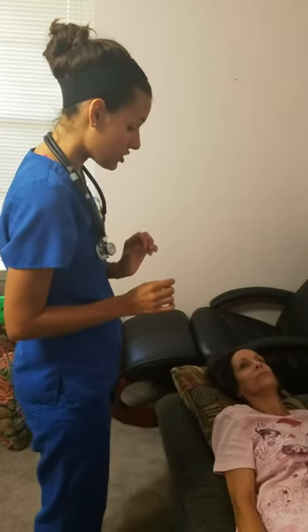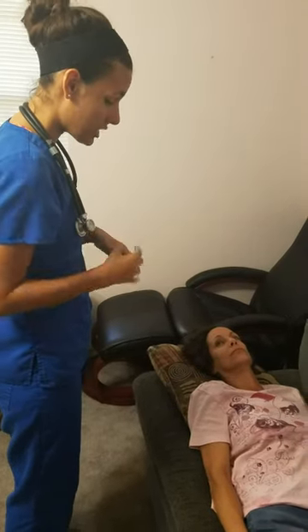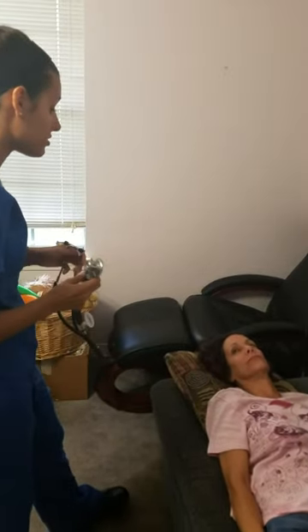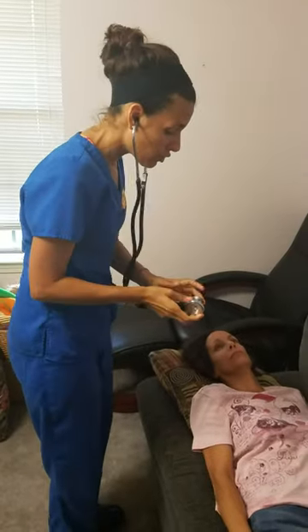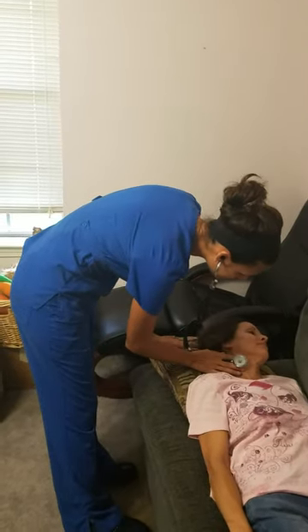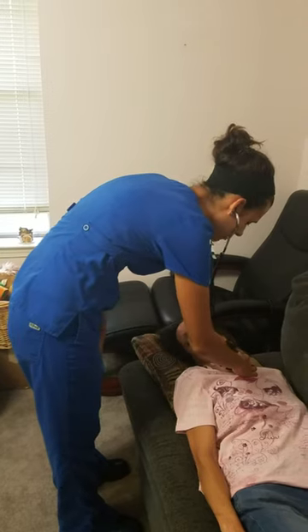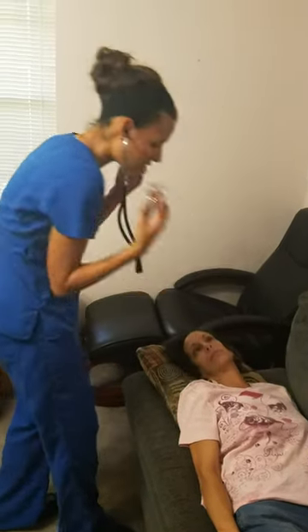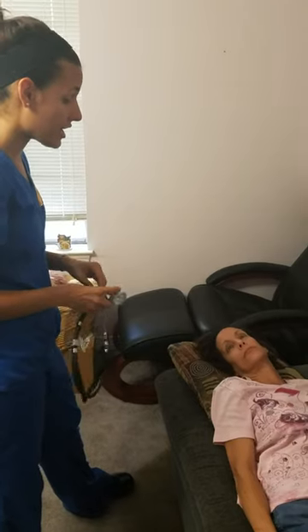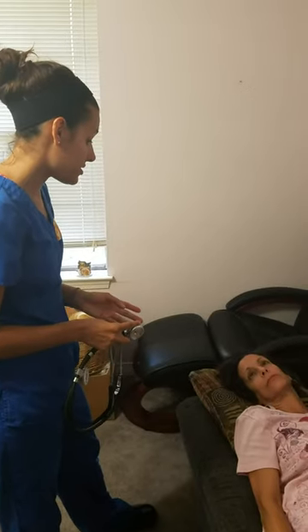Now we're going to go ahead and move on to your carotid arteries. I'm going to leave you in the supine position with the head of the bed 30 to 45 degrees. I'm going to use the bell of my stethoscope to first auscultate your carotid arteries so I don't slow down your heart rate or mask any sounds. Go ahead and turn to the left for me. Hold your breath. Good, let it out. Turn your head this way — hold your breath and let it out. I was listening for any type of bruit, which would be a swishing or blowing sound. I didn't hear that, didn't hear any abnormal variations from beat to beat, and didn't hear any weak or bounding pulses, which is good.